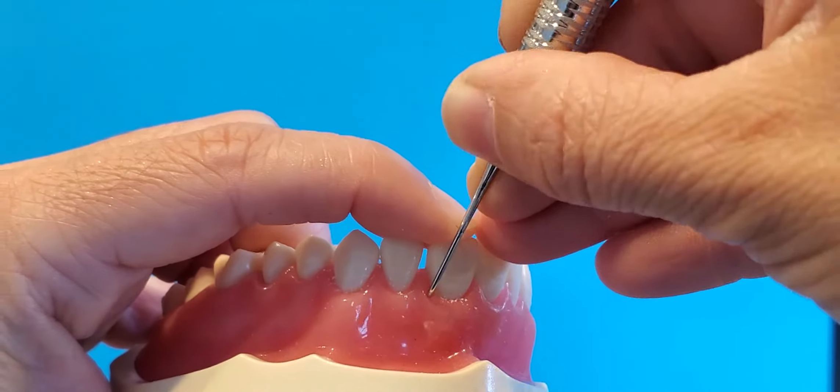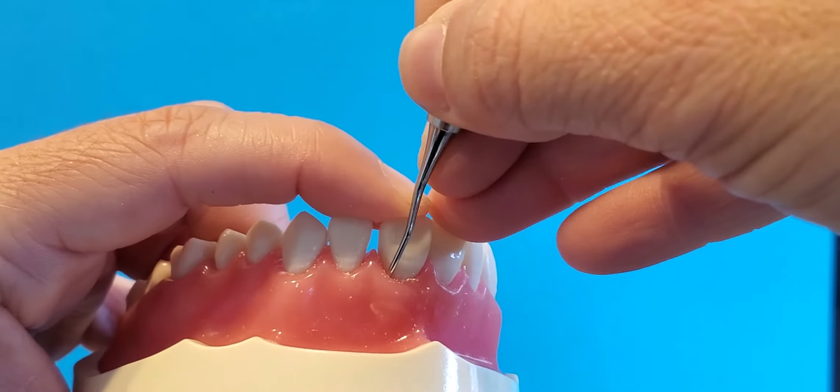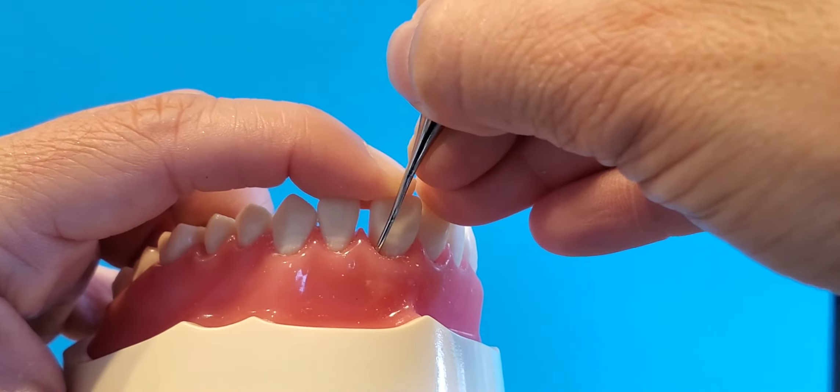What's great about these instruments is again that long shank — so if I have a really deep pocket, that instrument can go into that deep pocket in order to remove that calculus.